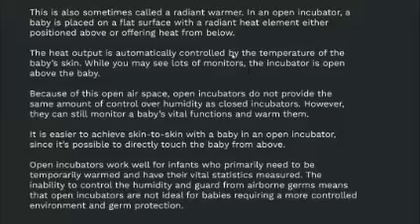This is also called a radiant warmer. In an open incubator, a baby is placed on a flat surface with a radiant heat element either positioned above or offering heat from below through a mattress. The heat output is automatically controlled by the temperature of the baby's skin. There is also a facility of a thermostat to change temperature accordingly to the need of the doctor.